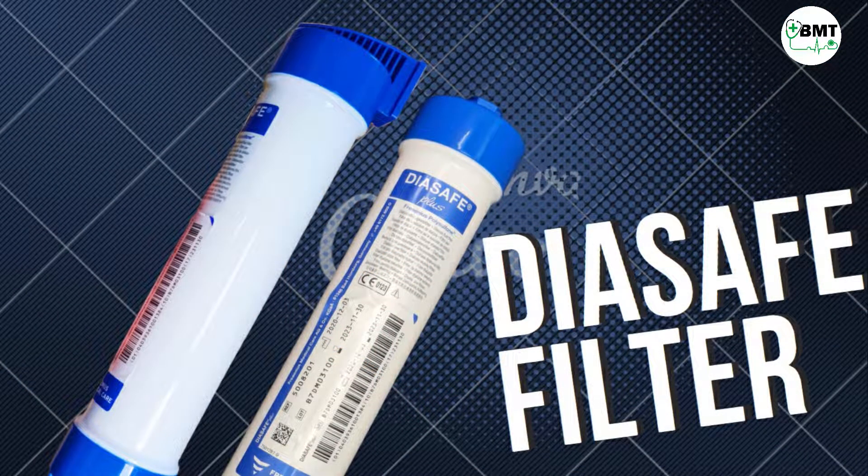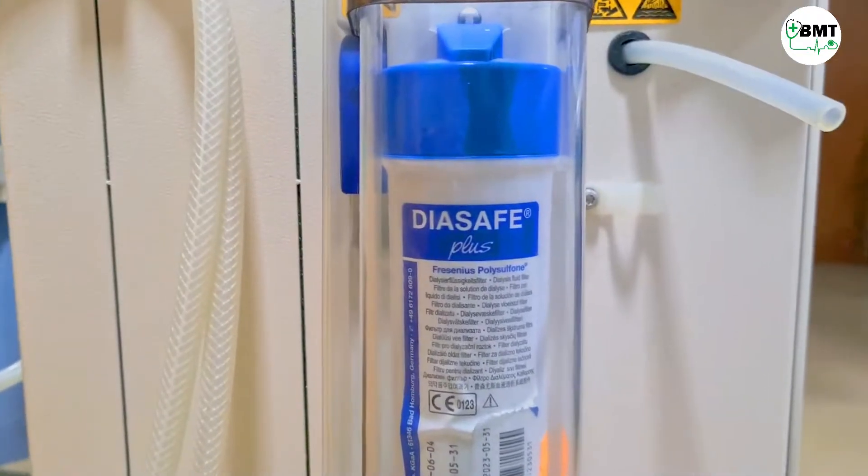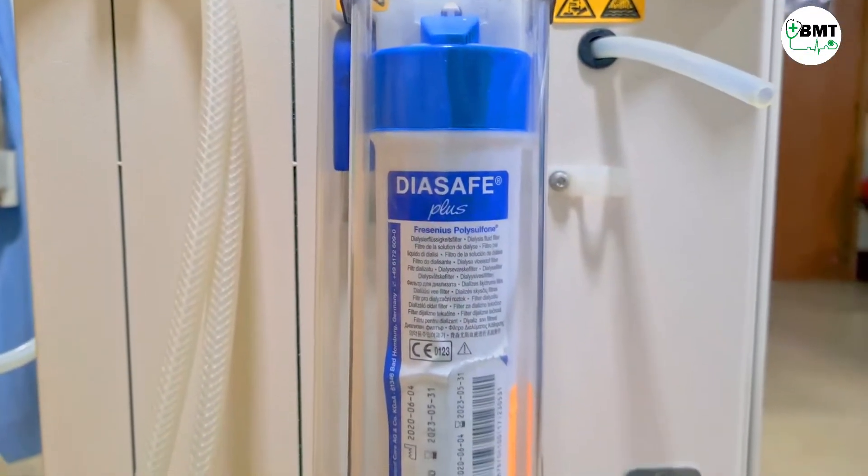Hello friends, today we will be discussing about the Diasafe filter of the Fresenius dialysis machine. In this machine, most commonly water error is found and 99% of the time the Diasafe filter needs to be replaced.